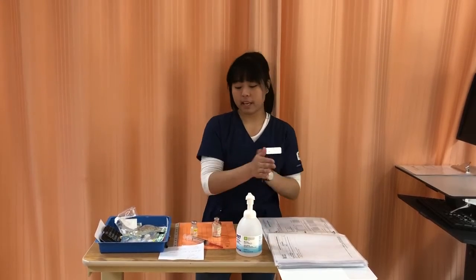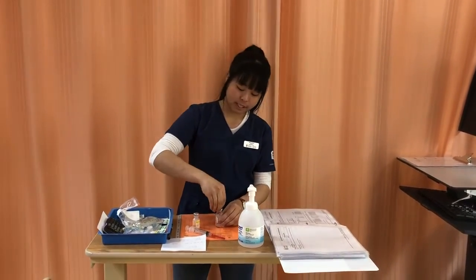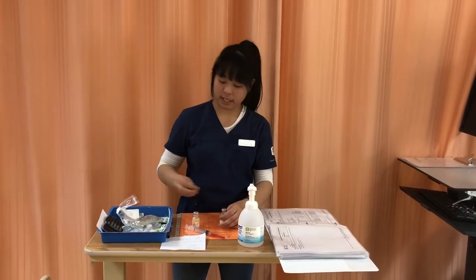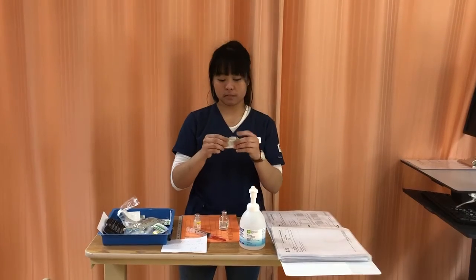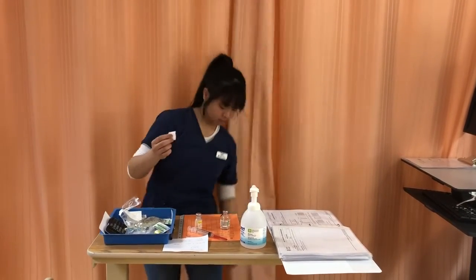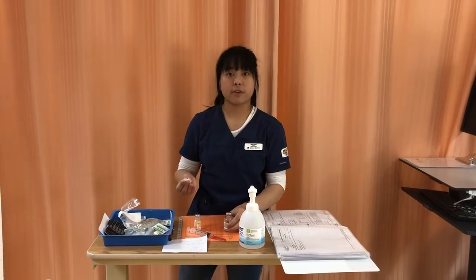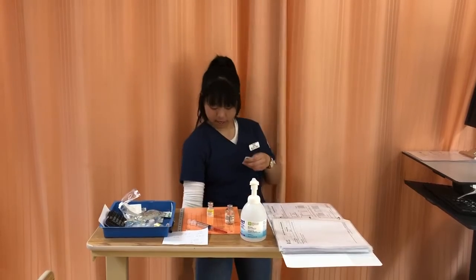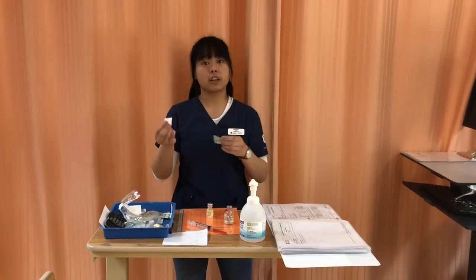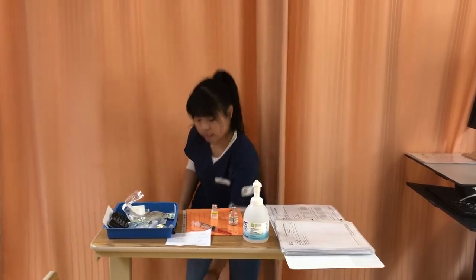I'm just gonna wash my hands again as I'm handling medication. Okay, so now I'm gonna pop the lid open from this vial, like so, and then I will be taking my alcohol swabs. Clean it for 30 seconds and let it dry for 15. For video purposes, I'm just gonna verbalize that. And then, as well as my other one, I'm gonna open another alcohol swab, clean it for 30 seconds, let it dry for 15. Like so.